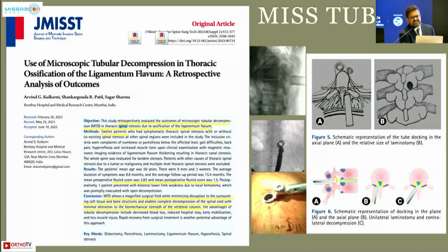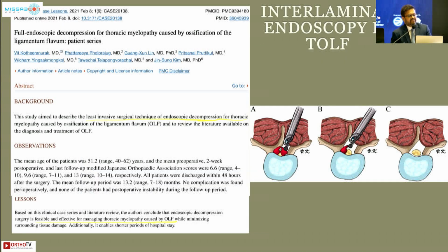They have very nicely shown the importance of docking, and in their paper they suggest that the docking should be from the lower border of the superior pedicle to the upper border of the inferior pedicle, and also illustrated how both ipsilateral and contralateral decompression can be done with a tubular system.